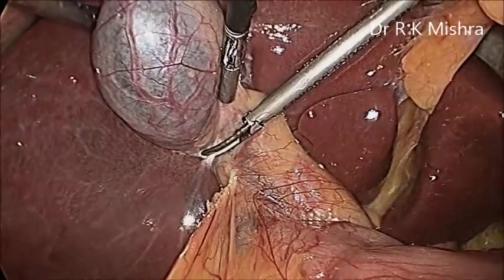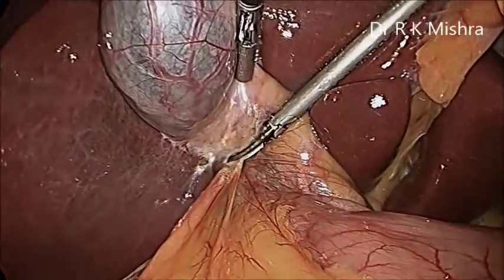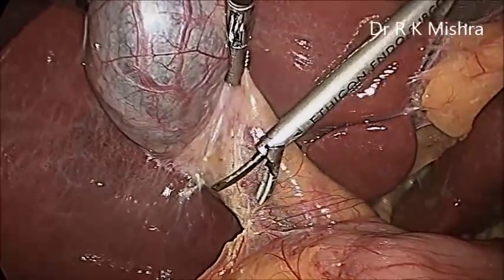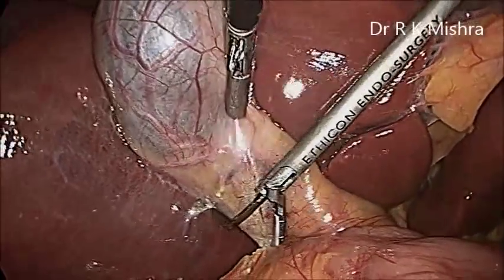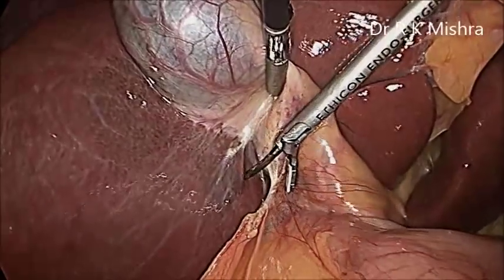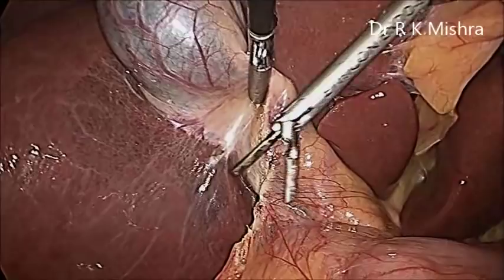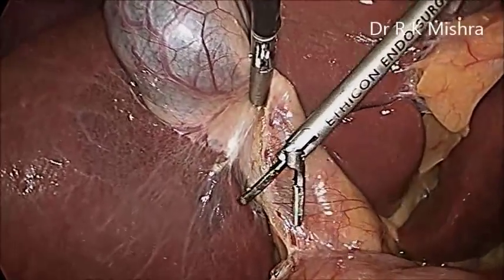Here we are dissecting at the level of the body of the gallbladder, the posterior peritoneum, and there is minimal adhesion which is separated. Right now this pedicle is looking pretty thick. Slowly we have to skeletonize, and we need to make a complete dissection and thorough skeletonization of the cystic duct and cystic artery.